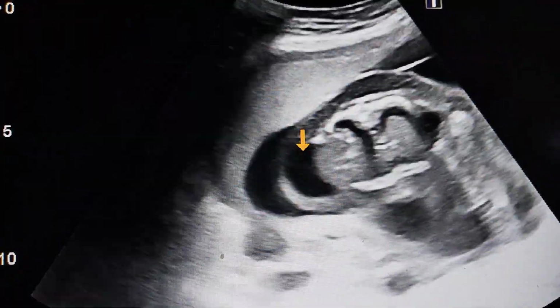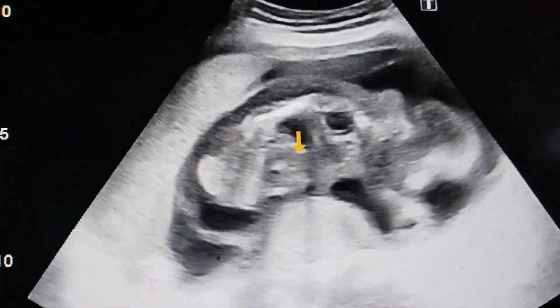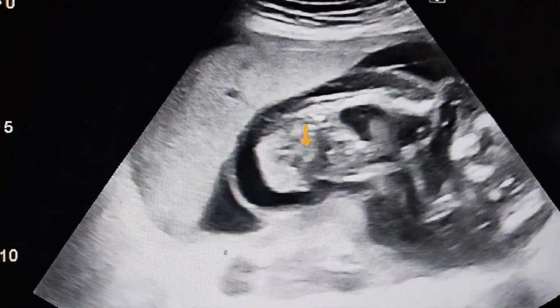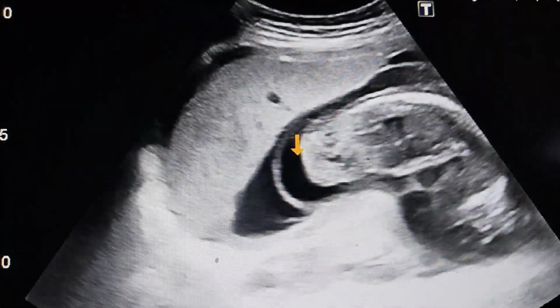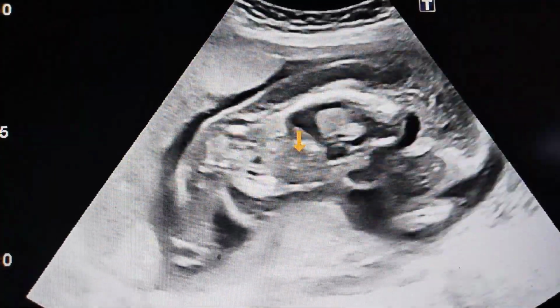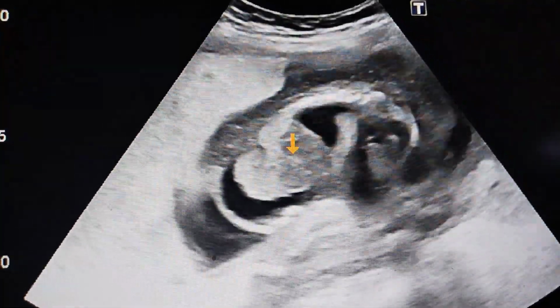We can say Hydrops fetalis only when fluid is present in two compartments, whether they are skin edema plus ascites, or skin edema plus pleural effusion, or pleural effusion plus pericardial effusion, and so on.